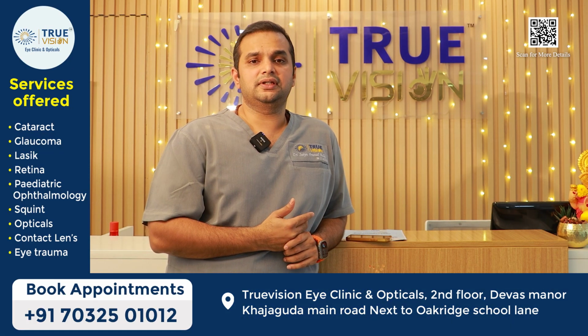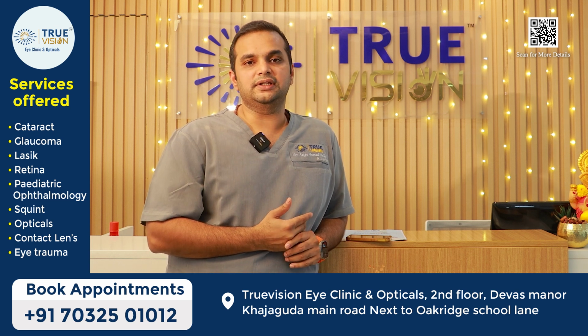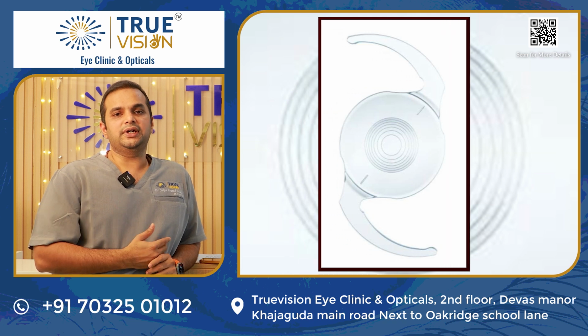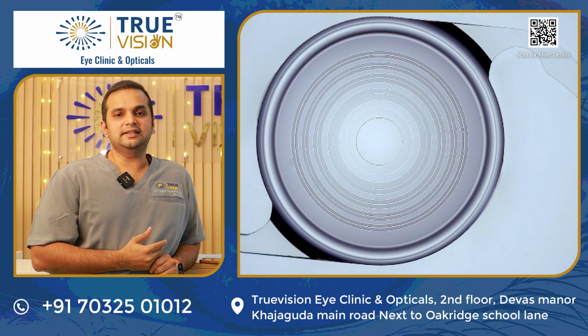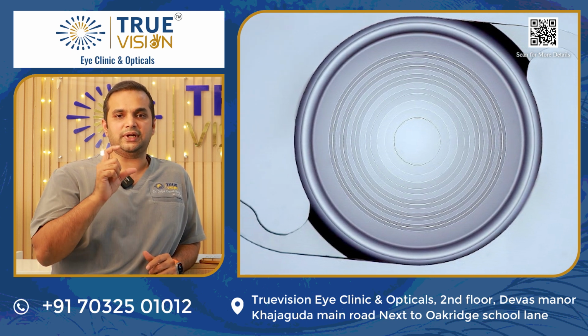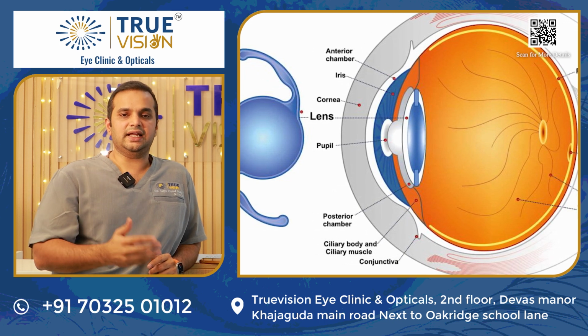Another type of lens which is more in demand right now is called the multifocal lens. Now, in a multifocal lens, you don't need to wear glasses after implanting this particular IOL. The reason being, this IOL has your distant and your near vision within one lens. Previously, it used to be called bifocal because it used to have your distant and near vision.